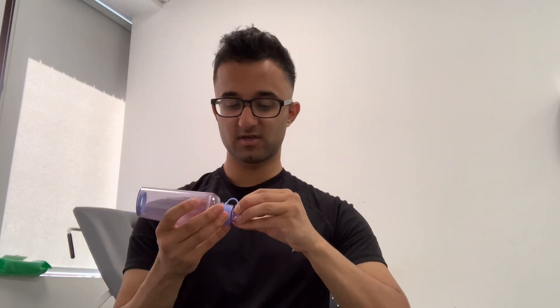When using your inhaler, you might have a spacer. You take the lid off your inhaler, place it in, take the mouthpiece off, spray it in, and then breathe it in.